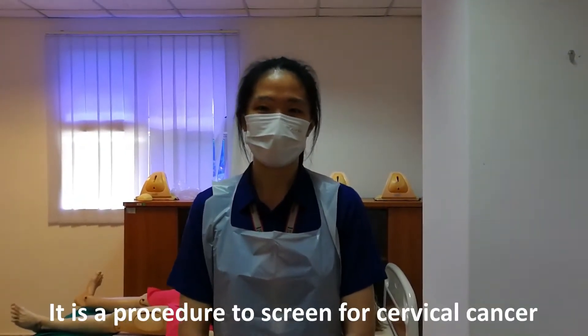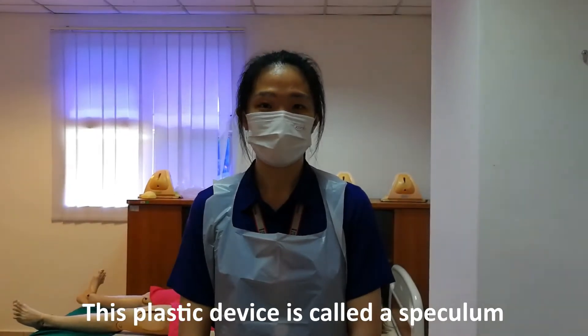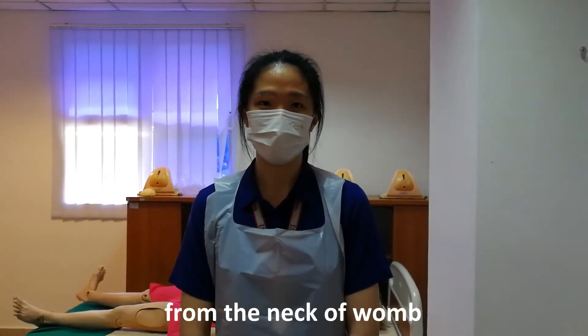It is a procedure to screen for cervical cancer. This procedure will involve me inserting a small piece of plastic device into the vagina. This plastic device is called a speculum. The speculum will allow me to visualize the neck of the womb, and I will also obtain a sample using a small brush from the neck of the womb.